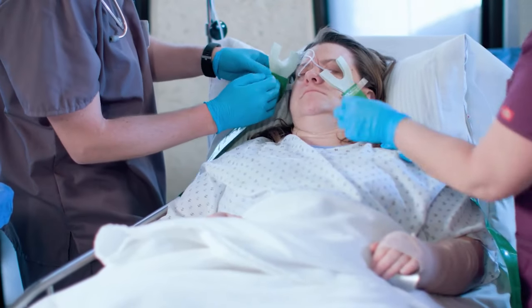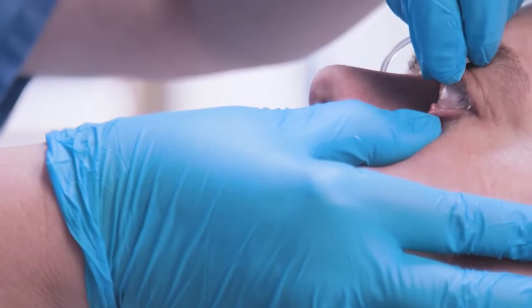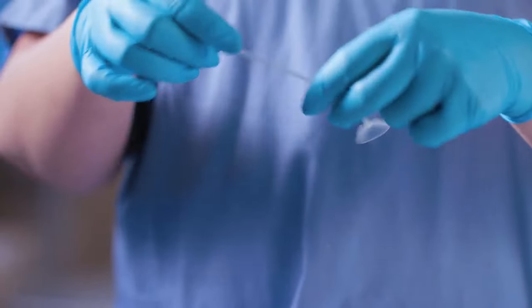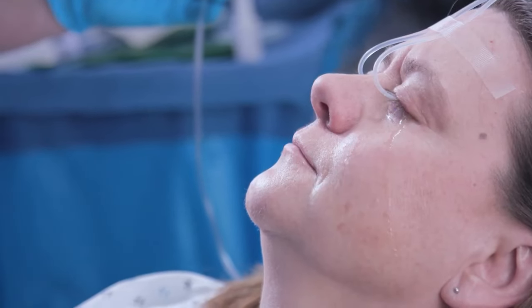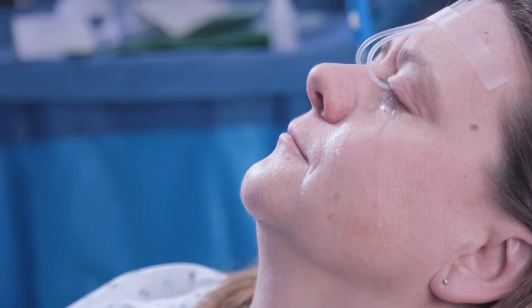Removal is just as easy. With the solution still flowing, instruct the patient to look up, retract the lower lid, and slide the lens out. Once the lens has been removed, stop the flow of solution and place the lens in a clean location. Recheck the pH after 10 minutes to ensure that it's remained neutral, and repeat the irrigation process if necessary. When finished, dispose of the lens properly.